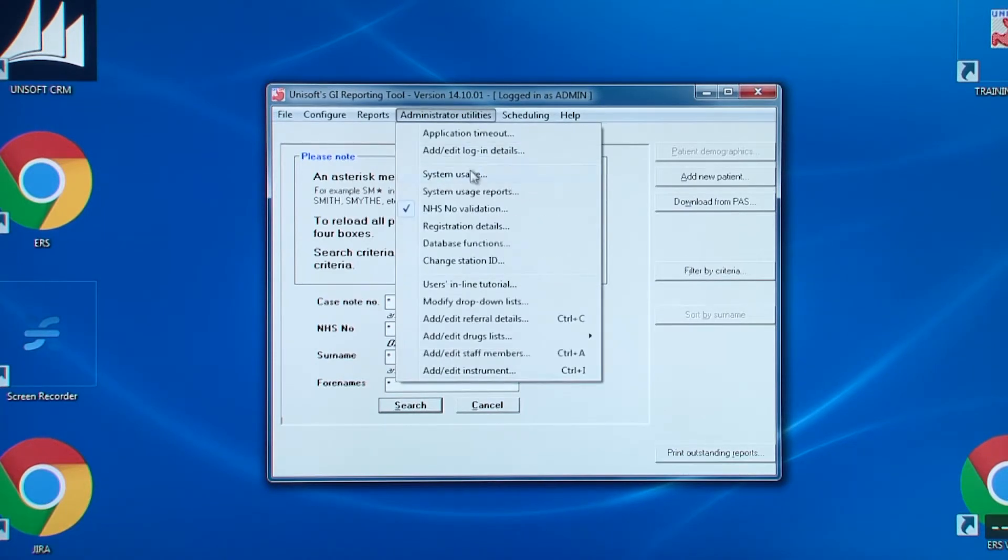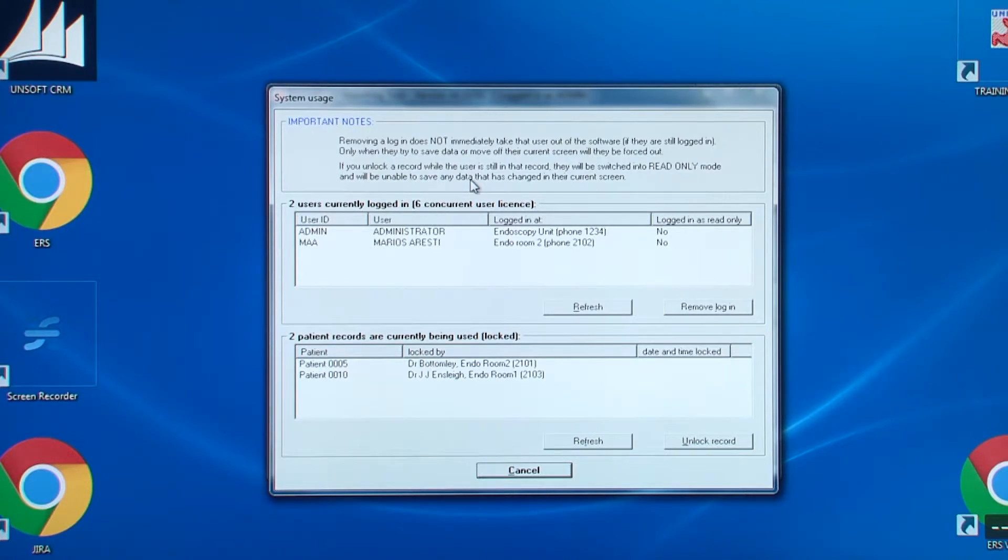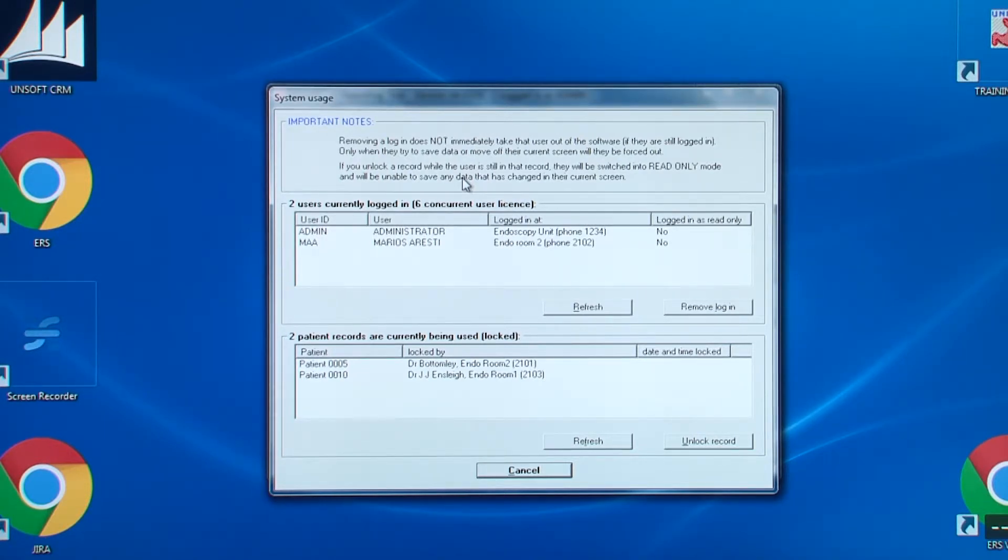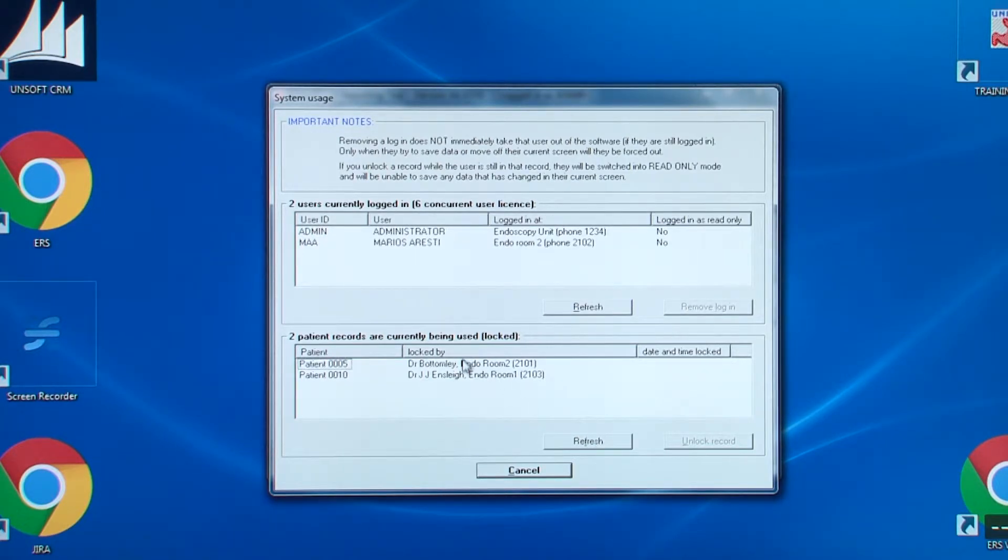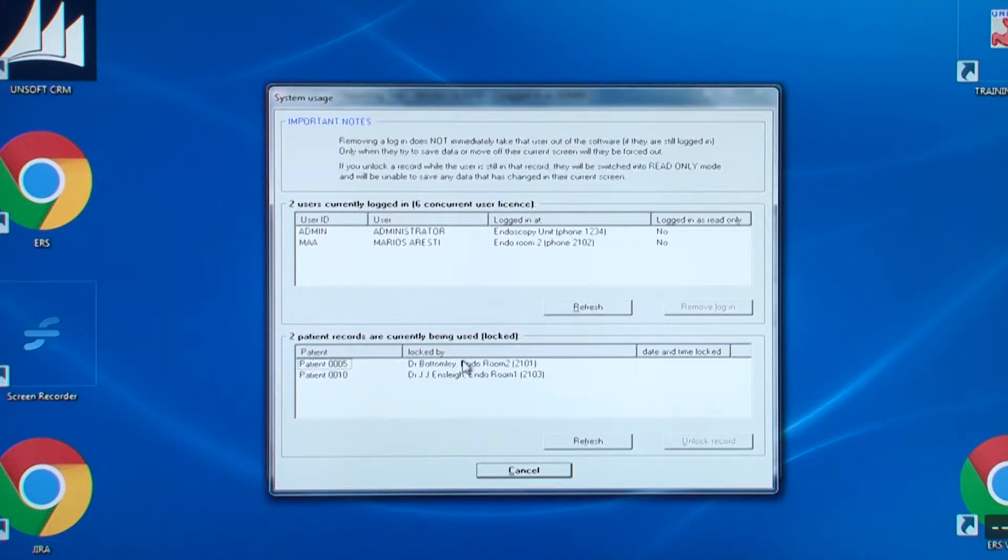Next, we are going to look at system usage. This tells you who is logged in and who is working on which patient records. This is a useful screen if, for example, the software has stopped abruptly. It may still show a user as being logged into a patient record, not allowing others to access it. If that happens, you can click on the lock record and click unlock record.